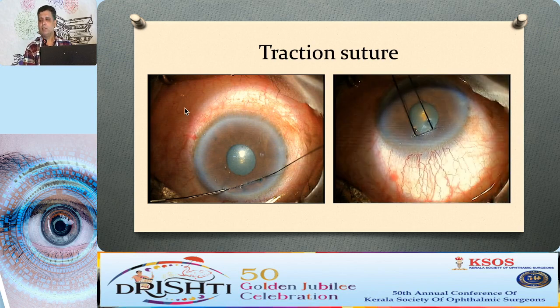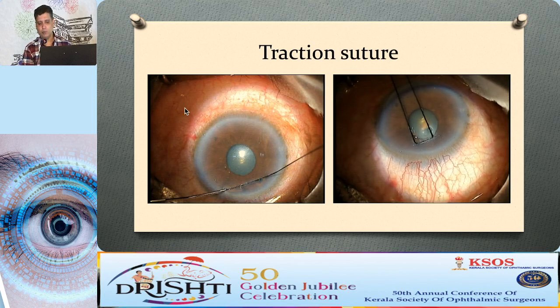So this is the important part of the corneal traction suture. It obtains very good vector forces and exposes a good area, and you will not end up with the very rare but possible chance of a superior rectus hematoma if you are using a bridle suture.